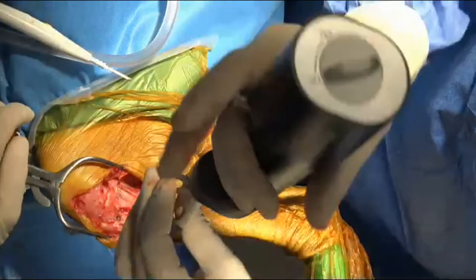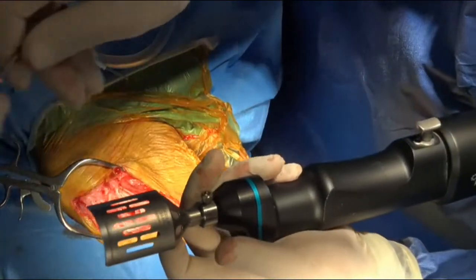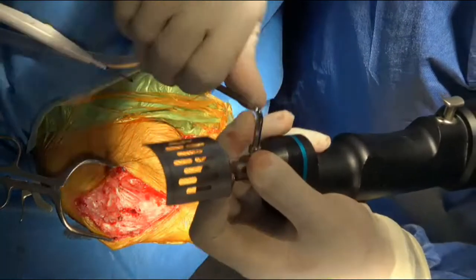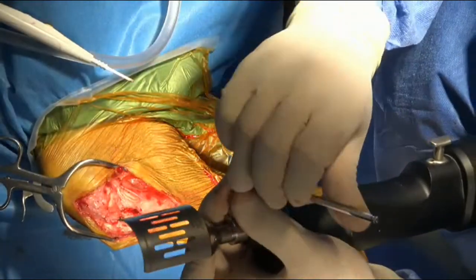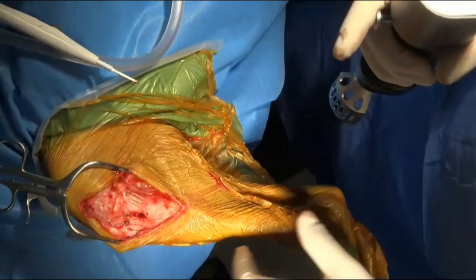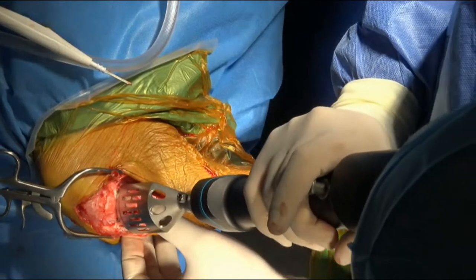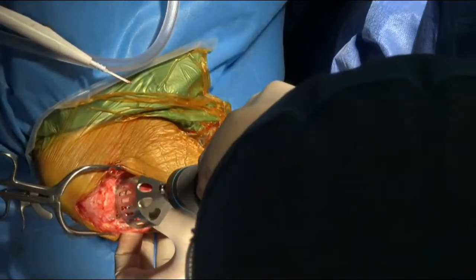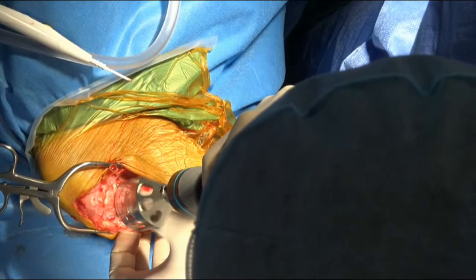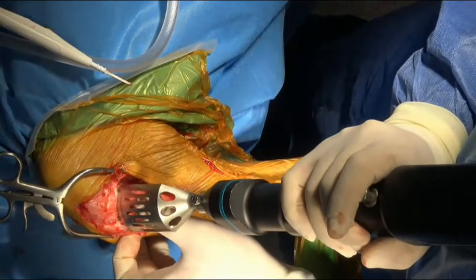Okay, I'm just going to go. So, I'll get it started, and then we'll get the flush going. Then we're going to have to measure up again, same as we do for TPLO. Have you seen a CBLO? Yeah. So, a bit different to a TPLO, just kind of like an upside down TPLO effectively. So, I'm going to start my cut here. Hate this saw. Just lift it up a bit more. That's it.